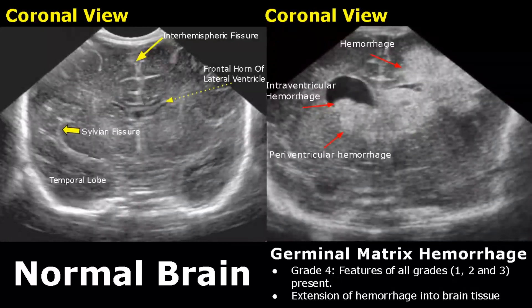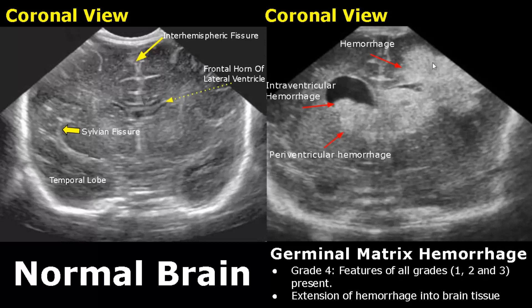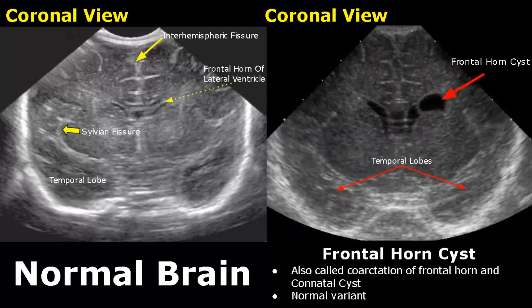In grade four hemorrhage, all features of grades one, two, and three are present. Furthermore, there is extension of hemorrhage into the brain tissue — the hemorrhage is present in the cerebral cortex.